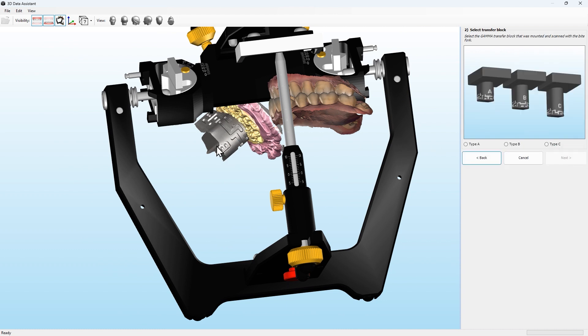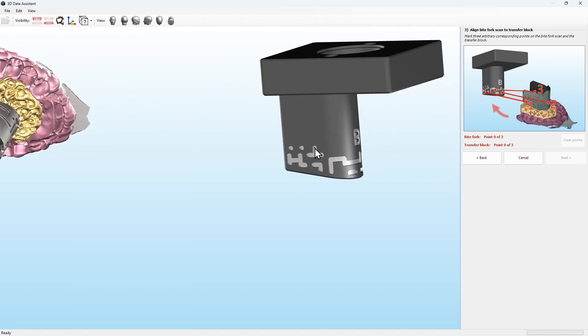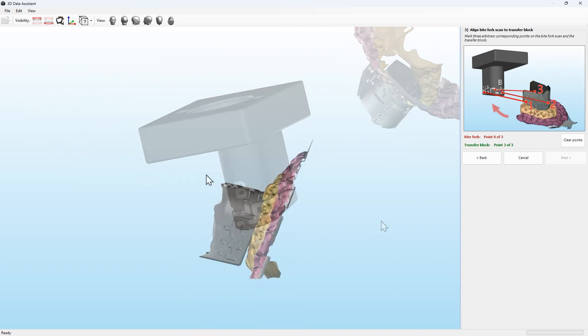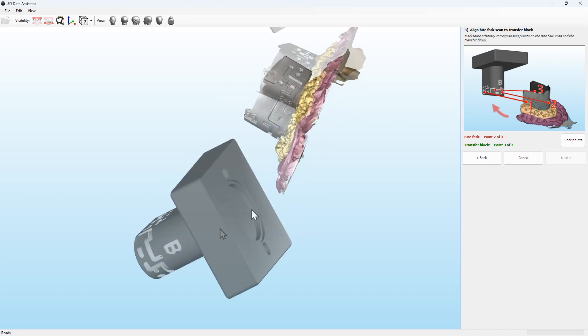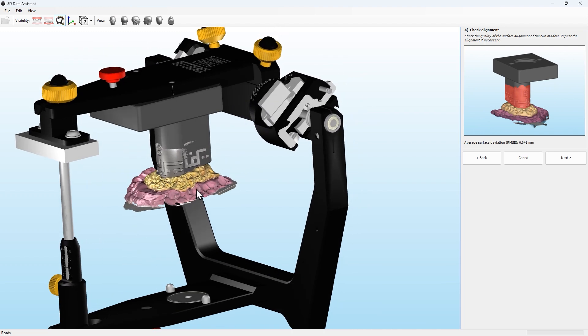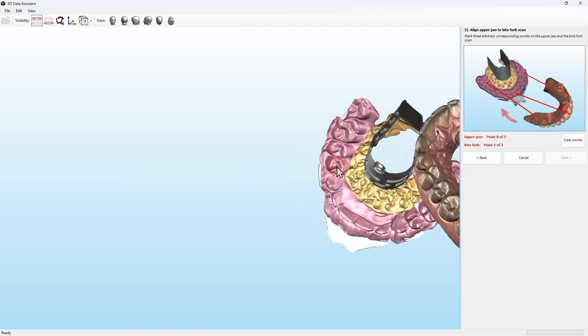Select the right type of digital transfer block, then follow the step-by-step assistant of the software and align the bite fork scan to the transfer block. The next step is to align the upper jaw to the bite fork scan.